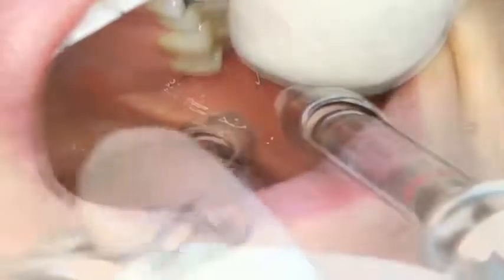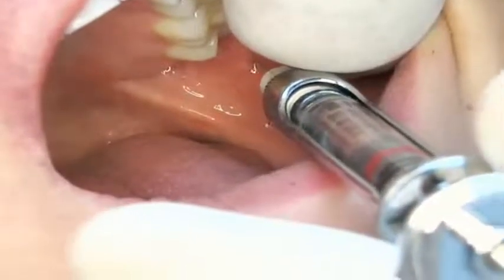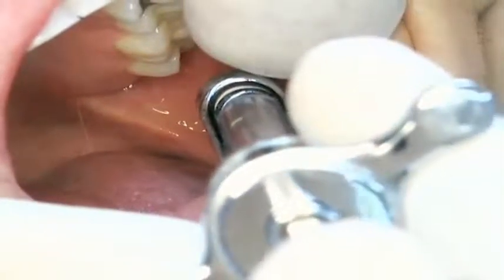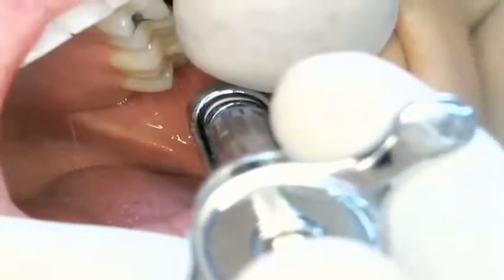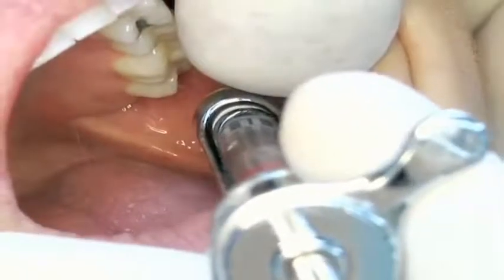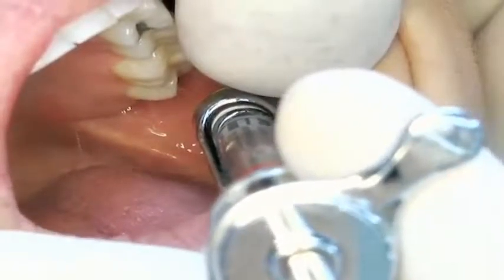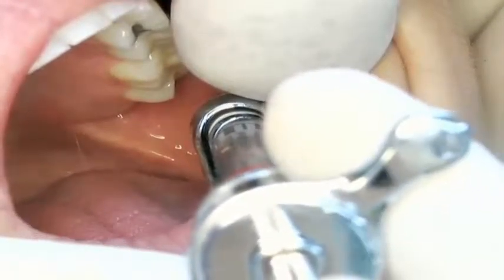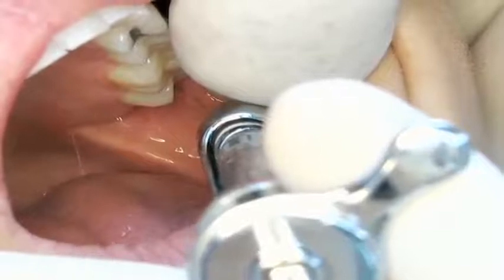The needle is directed to the intertragic notch and extended to the depth of the needle, which may or may not contact bone. The solution is deposited in this region, which is more proximal and includes more sensory nerves. However, the long buccal nerve usually requires a separate injection adjacent to the mandibular second molar.